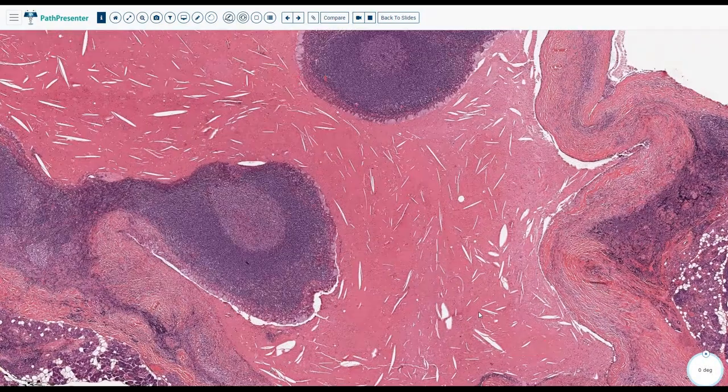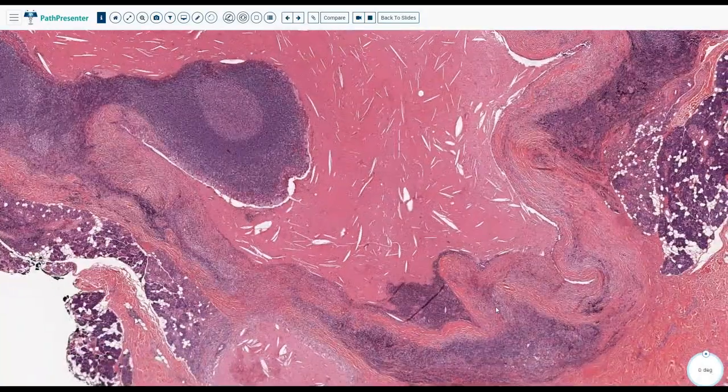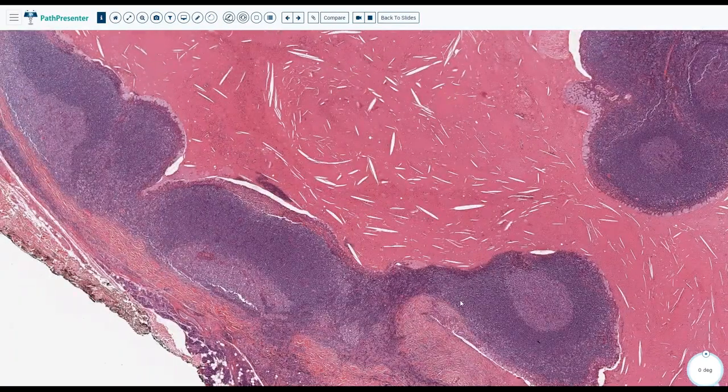If you see some atypia, and sometimes we see some squamous atypia, it is basically from trauma or whatever reason, and you'll be very worried. You see a dirty background, you think it's necrosis, and some squamous metaplasia, or atypical or dysplastic squamous metaplasia.